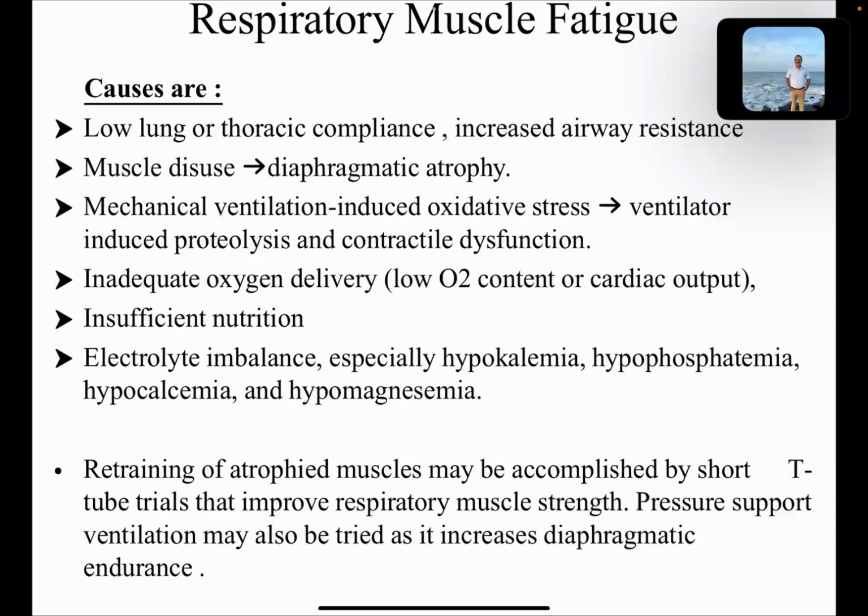For looking at diaphragmatic atrophy, there is a new method now. With a musculoskeletal ultrasound probe, we can assess the diaphragmatic thickness. That's a surrogate marker of inspiratory muscle weakness. In GBS patients in our ICU, we assess the diaphragmatic thickness, and gradually, after giving respiratory rehab or inspiratory muscle training, you can see whether you at least prevent the atrophy or not.